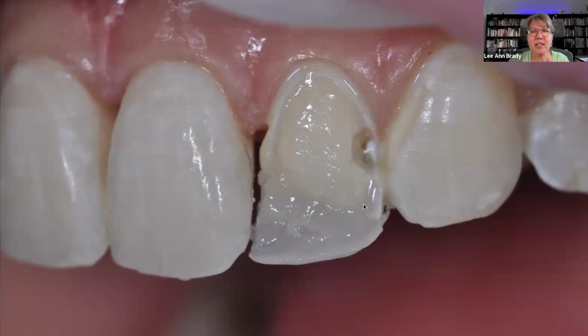So if I use my mouse, I'm going to add dentin composite, and I'm going to stay away from the interproximal, and I'm going to come about 1.5 millimeters, and I'm going to shape it. And then I'm going to come back down here, and that layer is going to be pretty much the same thickness as her dentin here. And it's going to taper off and be very thin, maybe 0.5 millimeter as I approach the incisal edge. And then I'm going to light cure it.